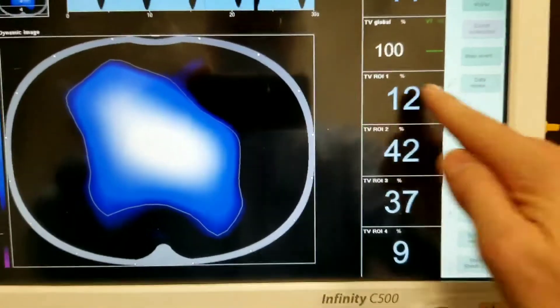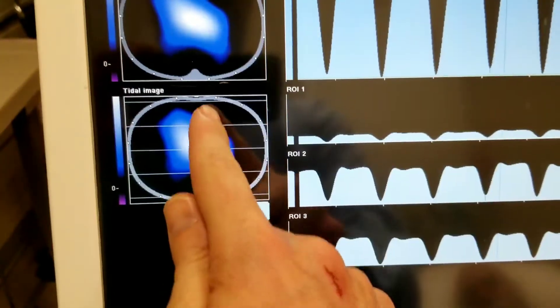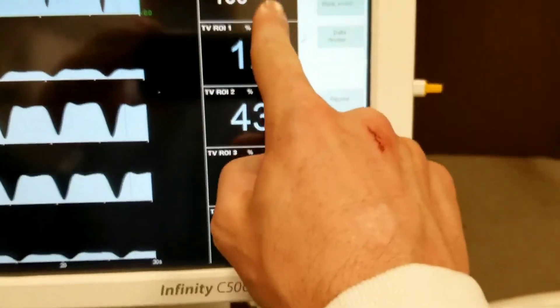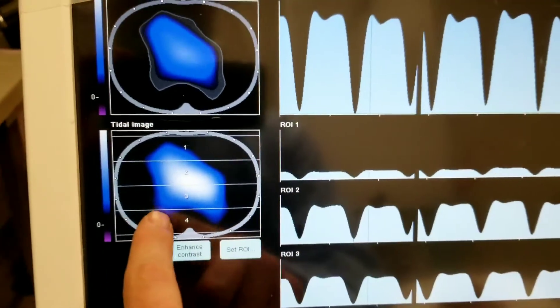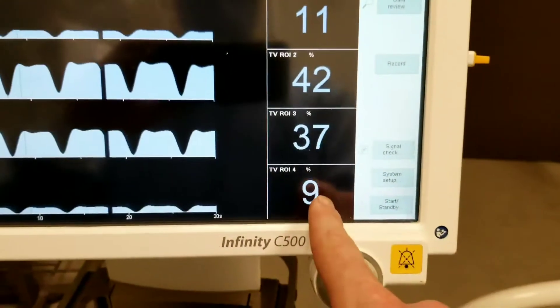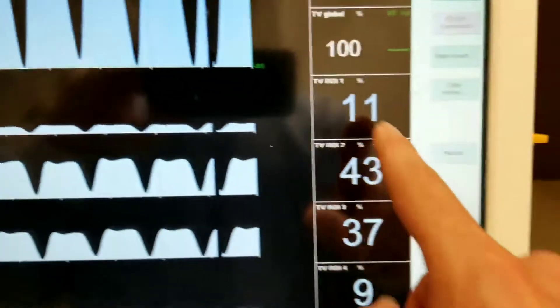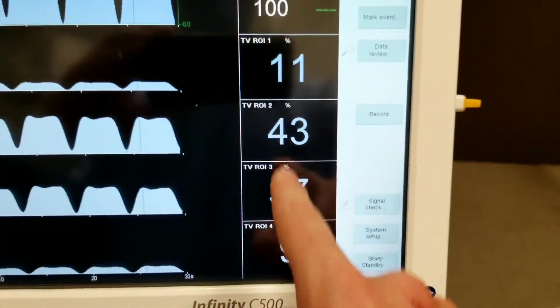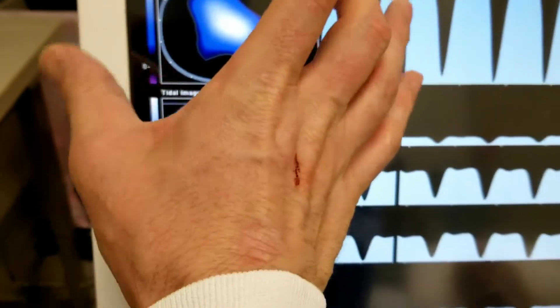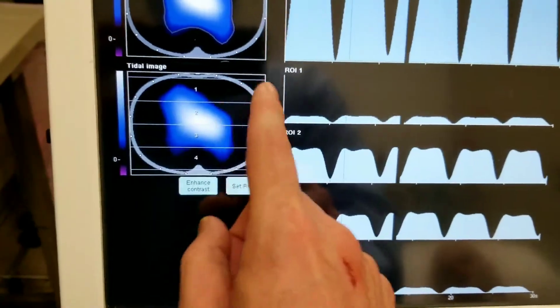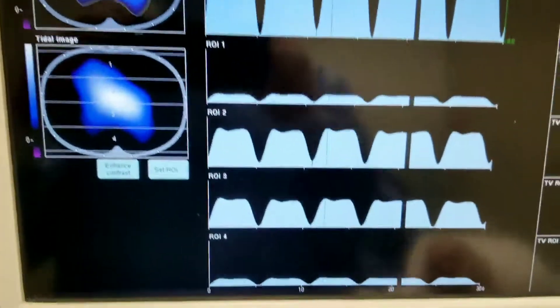These are the regions of interest. On the main screen, you'll see region 1, 2, 3, and 4. This is a caudal-to-cranial view, similar to a CT scan perspective. The gravity-dependent regions are here — dorsal, mid-dorsal, mid-ventral, and ventral. The normal is 8 to 15%. These two middle regions here are 35 to 40%, then 8 to 15%. Even though the box isn't filling completely blue, that's because the patient has obesity, which makes the image smaller. We can adjust the frame slightly smaller to account for the obesity.